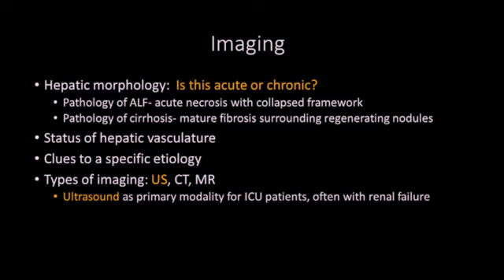As I mentioned, there are no specific guidelines for imaging these patients, but in general, the vast majority of them will receive some type of imaging. And that imaging often will be only ultrasound. The reason for this is they are so sick, they are in intensive care units, and we can bring the ultrasound to the bedside. They may not be well enough to even be brought to a CT scanner or an MR scanner. What is the purpose of doing imaging in these patients?